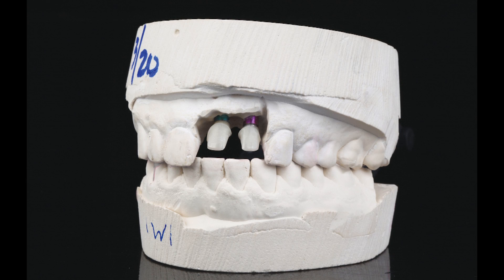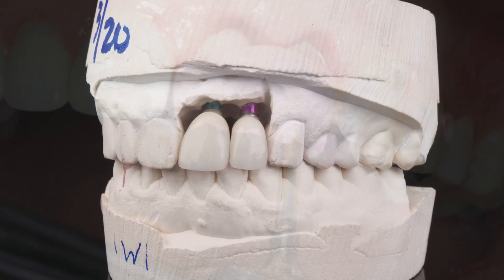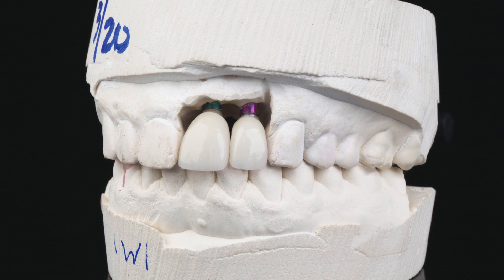Inclusive zirconia custom abutments were produced by the lab, maintaining ideal soft tissue contours and emergence profile. A seating jig helped keep the abutment stable while the prosthetic screws were torqued into final seating, which is critical for meeting the aesthetic desires of the patient. Note that the dental models are shown without soft tissue material. Bruxer anterior material, a monolithic zirconia material specifically formulated for the smile zone, was chosen for the final restoration because of its strength and lifelike aesthetics. The all-ceramic material exhibits long-term durability and natural translucency, especially in combination with zirconia hybrid abutments.